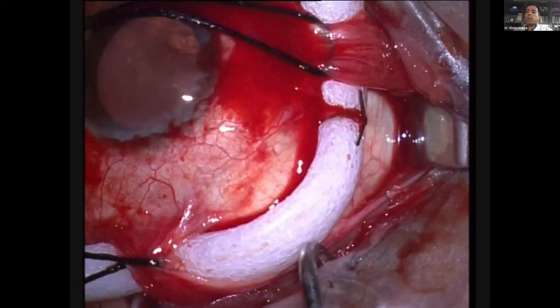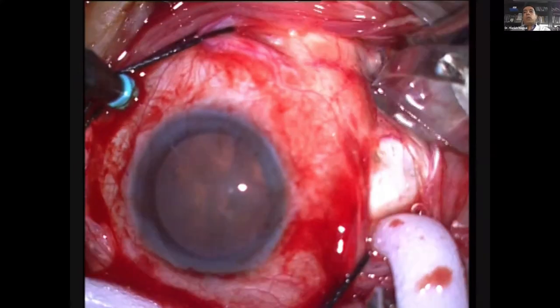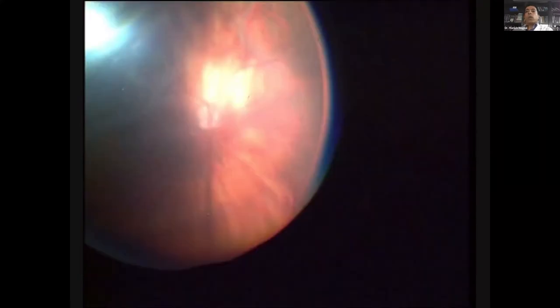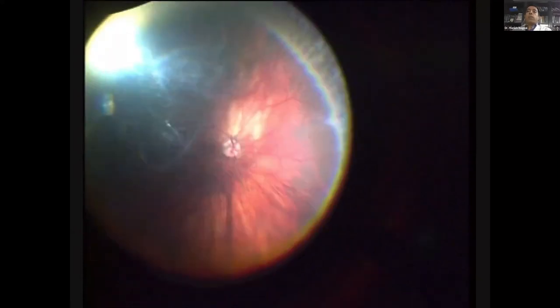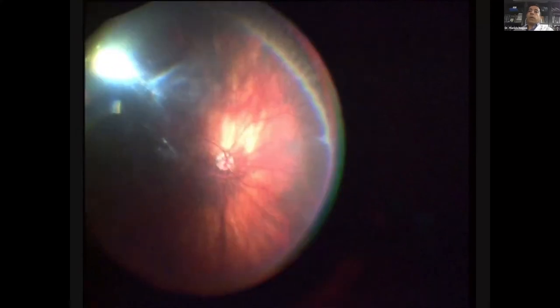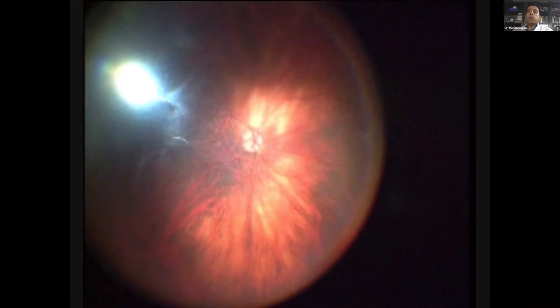In this myopic eye with inferonasal detachment, all steps are the same as classic buckling with indirect ophthalmoscopy, except you see inside with a contact or non-contact system. All external steps happen under a microscope — take the localizing stitch, do diathermy, define the area of drainage, then do needle drainage with fluid coming out. After that, look inside at the drainage site to ensure no bleeding. If there is bleeding, apply pressure. Then check the buckle effect — the retina is flat.